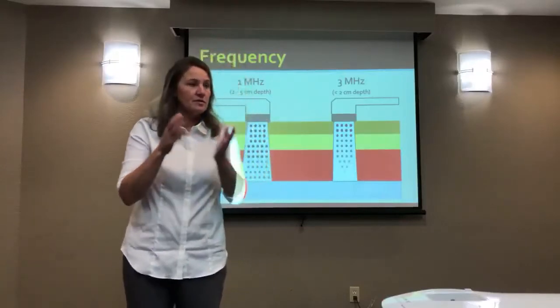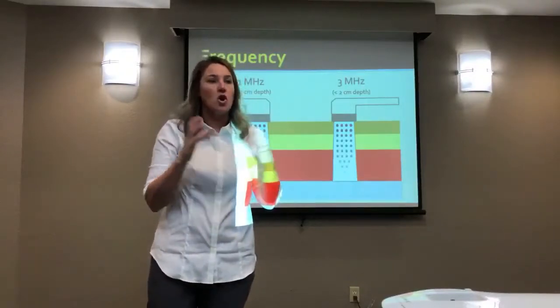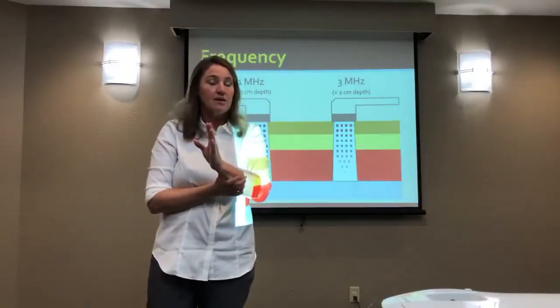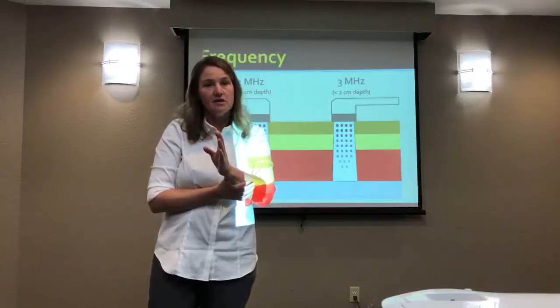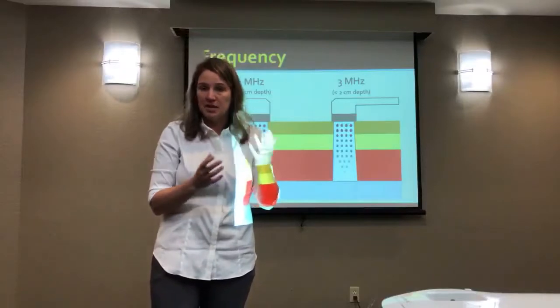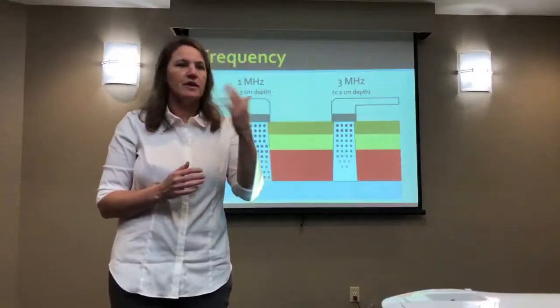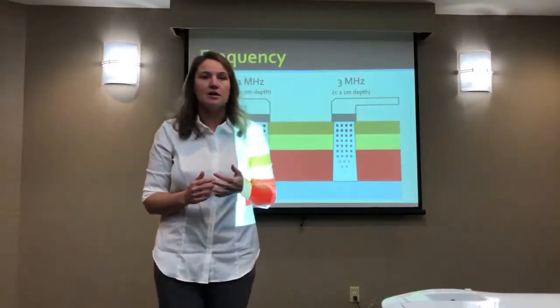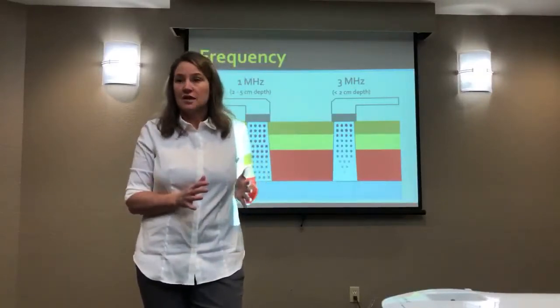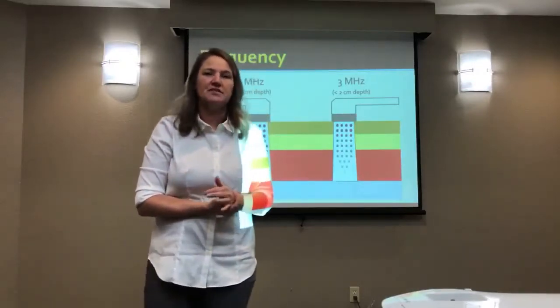It gets absorbed at a superficial level. The ability to vibrate at such a fast rate causes it to be reflected, refracted, and absorbed at a more superficial level. It also is a higher intensity. So the ability of it to cause kinetic energy absorption and potentially heating up a tissue is greater as well. So there's 3 times more energy, more vibrations being delivered, but it can't go very deep. So if you have a target that lies more than, even close to 2 centimeters, you're going to have to go with 1 megahertz. So 1 megahertz has been found to go up to 5 centimeters deep.